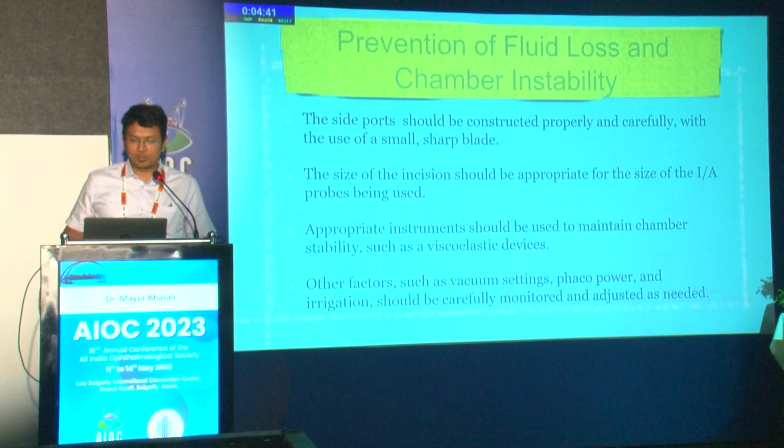The size of the incision should be appropriate for the size of the IA probes also used. So there are different gauge IA probes we get. The appropriate instrument should be used. Other factors like vacuum setting, phaco power, irrigation should be carefully monitored and adjusted.